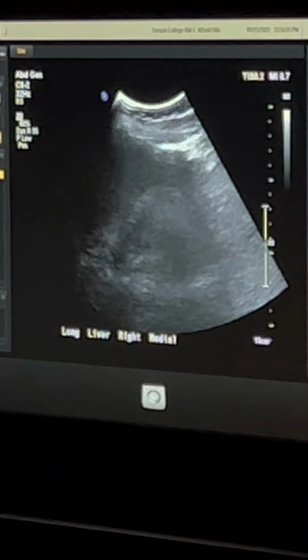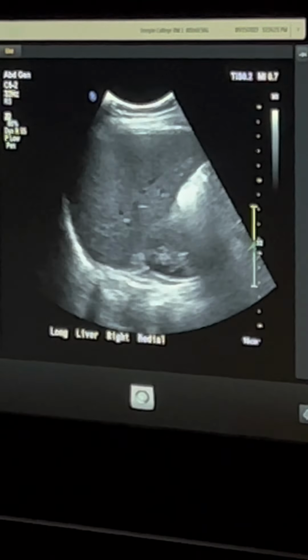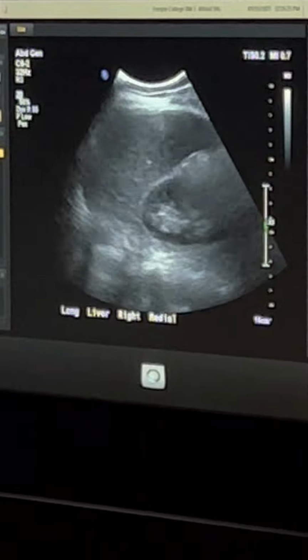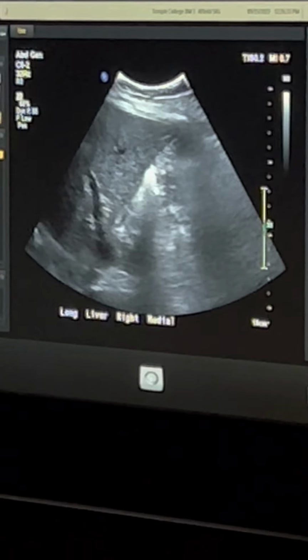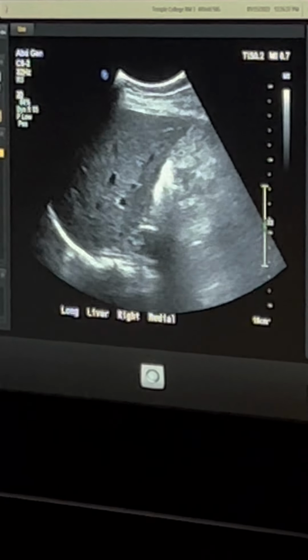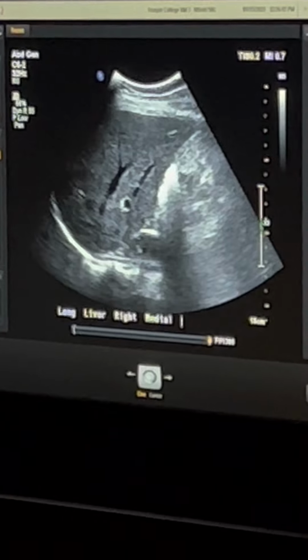So you probably won't just have like one lateral, one mid, one medial picture when you're scanning intercostally, and sometimes even subcostally. You may have two pictures just to show around your rib shadows and to make it fit on the screen. Sometimes you're gonna have these livers that aren't gonna always fit completely. That's a really pretty mid picture, completely on your screen.